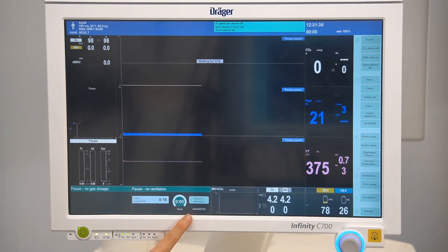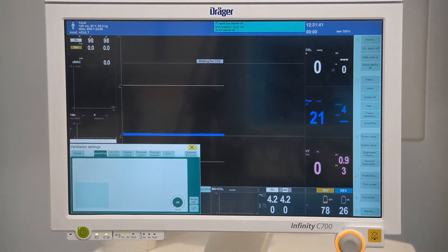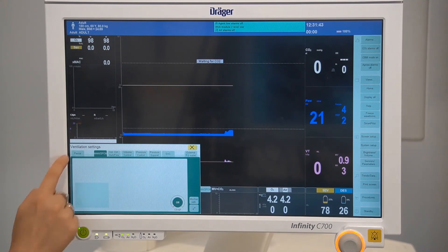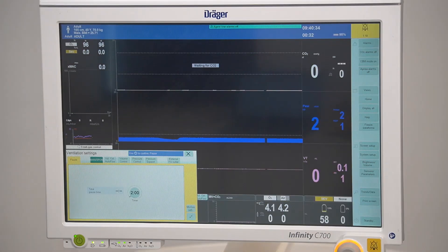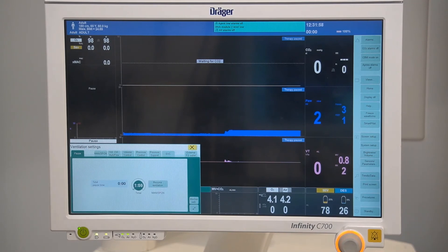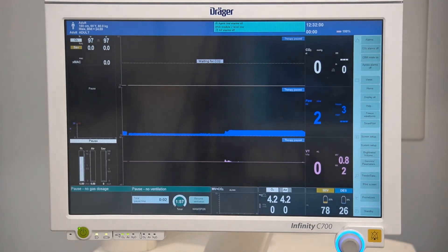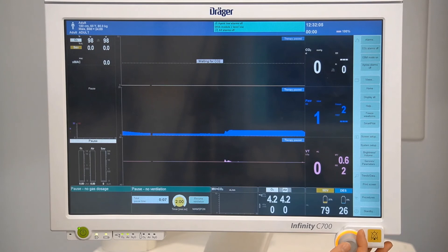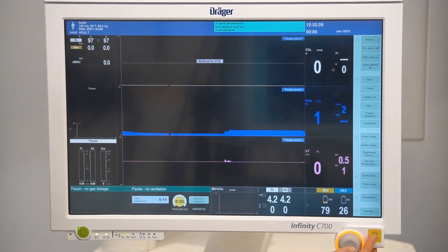If you were to enter a ventilation mode and then go back to pause, a 2-minute safety timer will be triggered for the adult patient profile. For paediatrics it will be 60 seconds, and 30 seconds for neonatal patients. The timer can be readjusted if safe to do so, to either off or up to a maximum of 60 minutes.